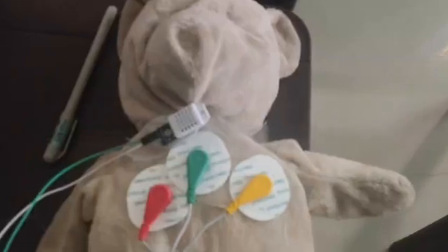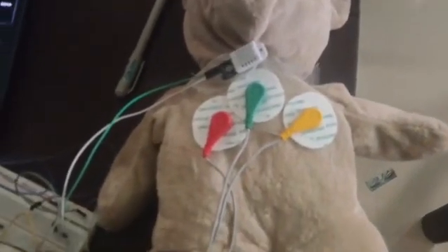Next, the ECG sensor. The ECG sensor is used to measure the heart rate and the electrical activity of the heart. It detects abnormal heart conditions and sends the continuous heart data to the Raspberry Pi.